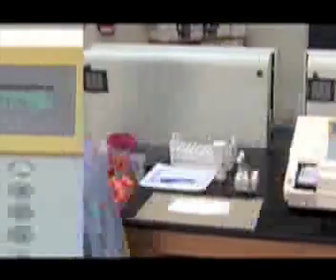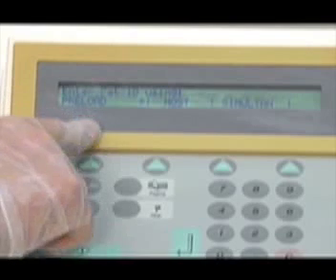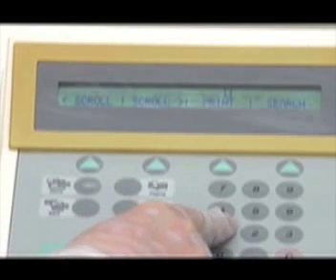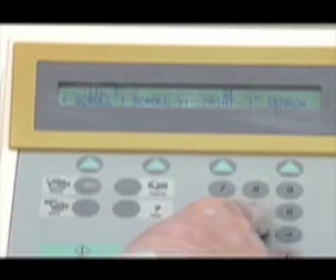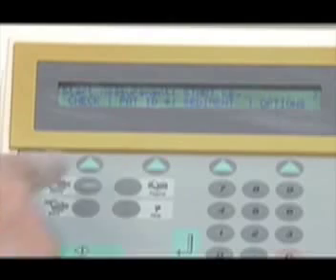The next step is to enter the identification for the quality control. From the home screen, press ID, and then preload, and press sample 1 as the first quality control sample number, and press the Enter ID button. To enter the second quality control, press number 2, and then the Enter ID button. Once this is done, press Start to begin sampling.